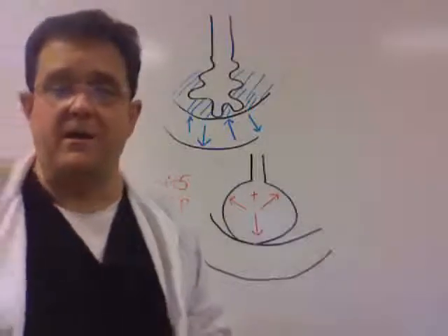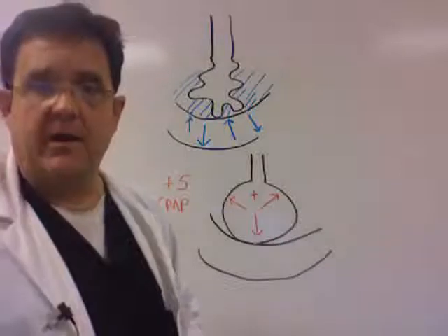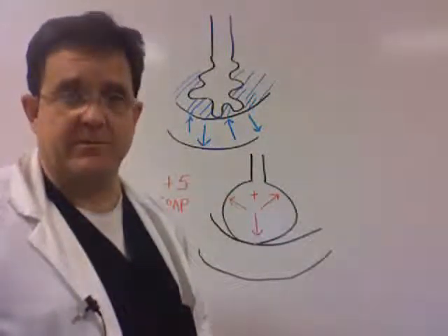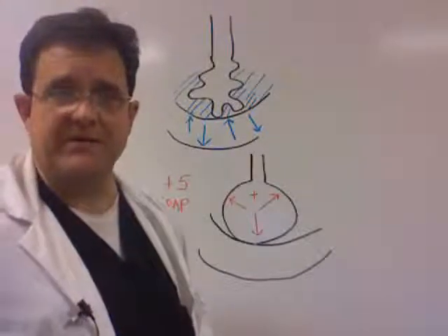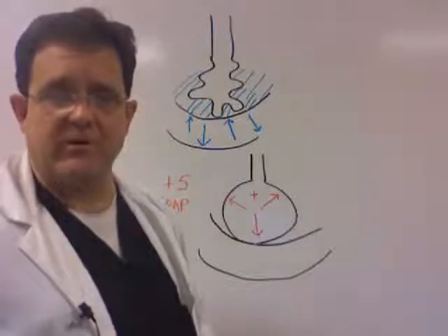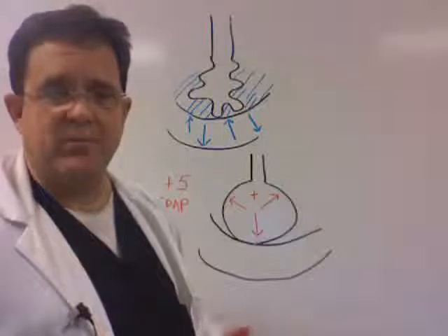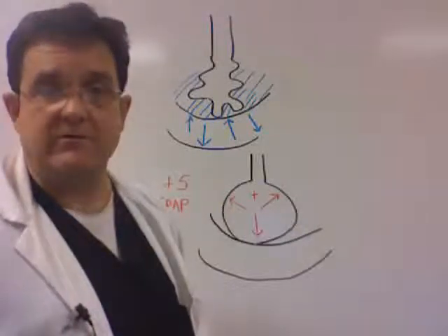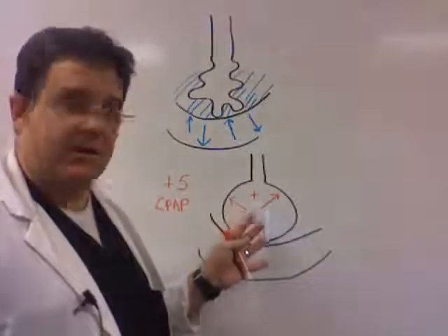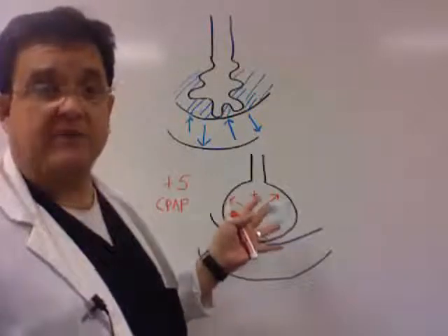And it can be dramatic when you put a patient in refractory hypoxemia on CPAP. It can make a dramatic difference. A person that was barely able to maintain an oxygen sat of 90% on 100% non-rebreather, suddenly on 5 or 10 of CPAP, that patient can be weaned down to a low FiO2 with the addition of the 5 CPAP. So it makes a dramatic difference. And so it was discovered that this worked very well. However, there's a downside.